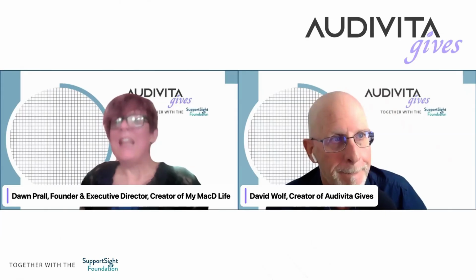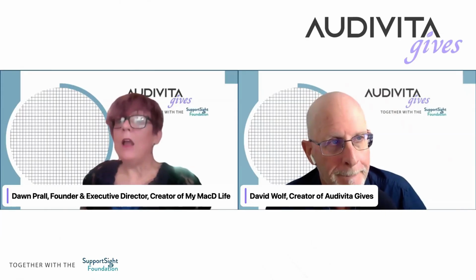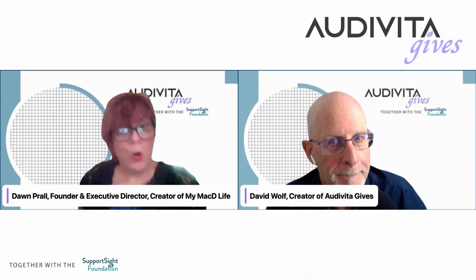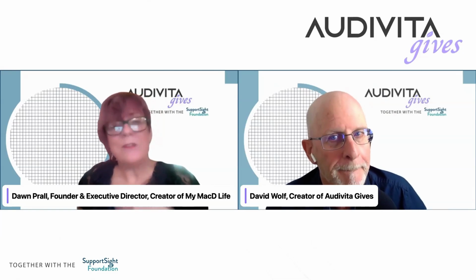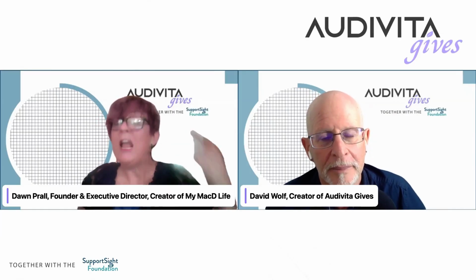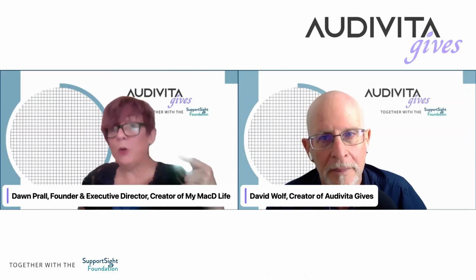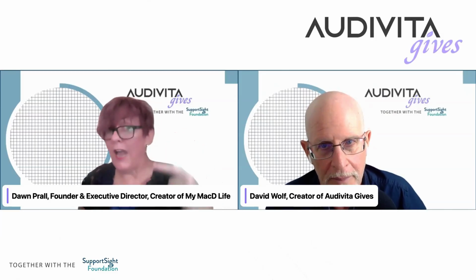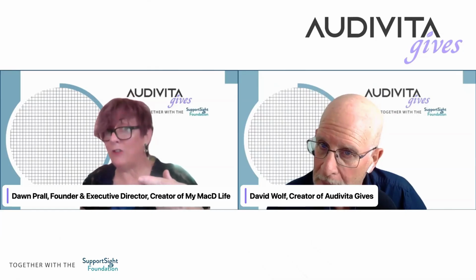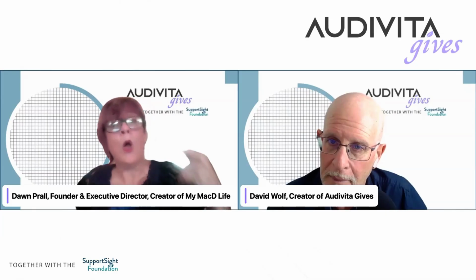Okay. So again, there's a level of fear here, folks. We're not stoking that, but I am telling you that the Amsler grid literally is the only way that you will know if you're going from dry macular degeneration to wet, because it's going to change the way your brain sees that Amsler grid.